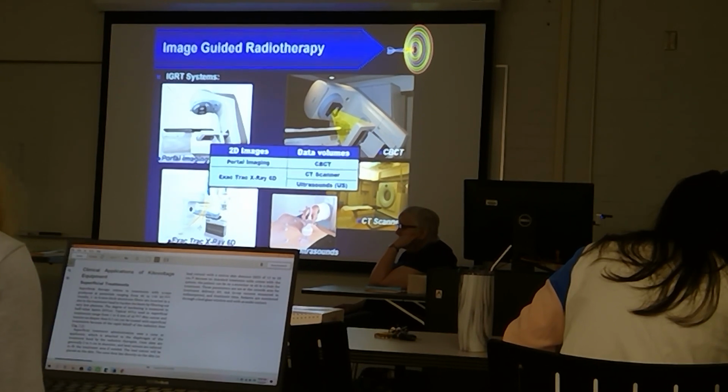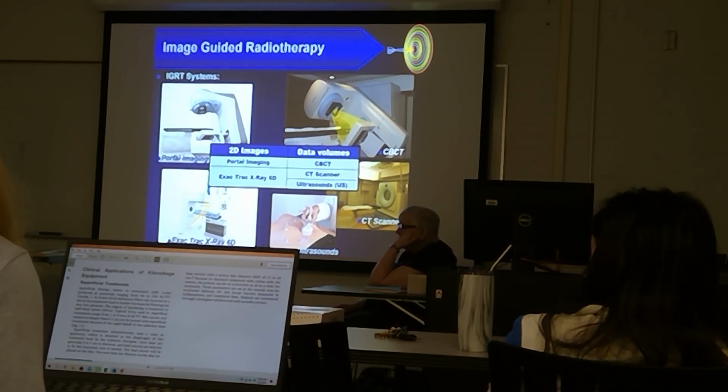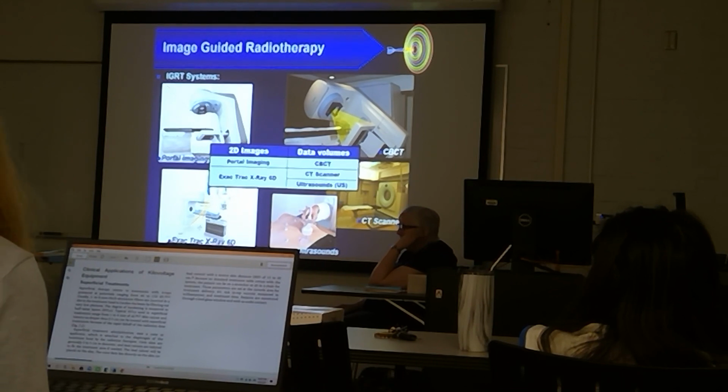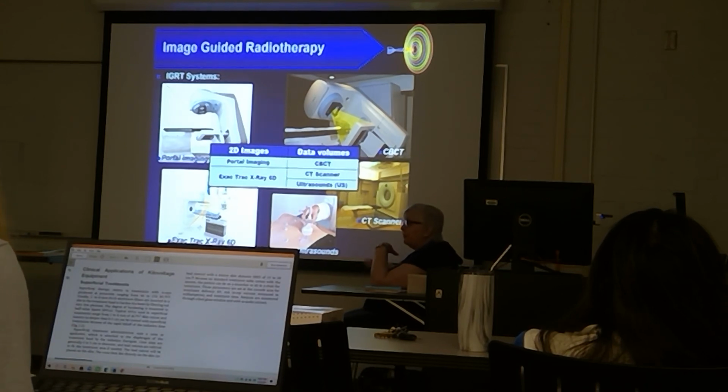So basically, they highlight an area of the patient that they want to focus on, and then I reposition the patient after all that, again, to get that lined up, and if they move out of that little space at all, alarms go off. That's exactly the same thing. It's a version of the same thing, just made by a different manufacturer.